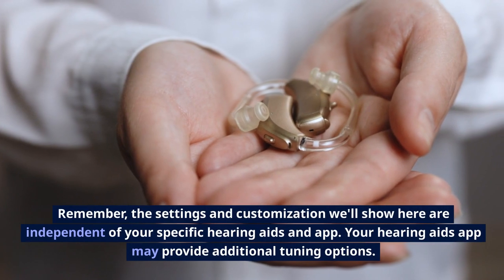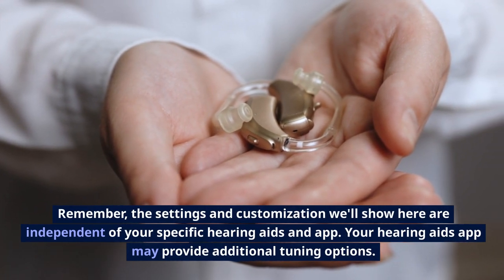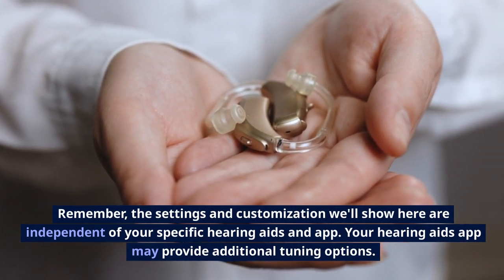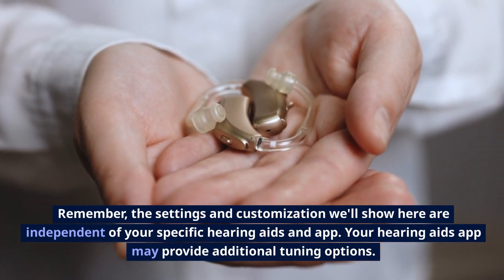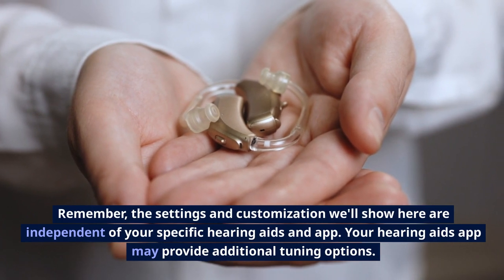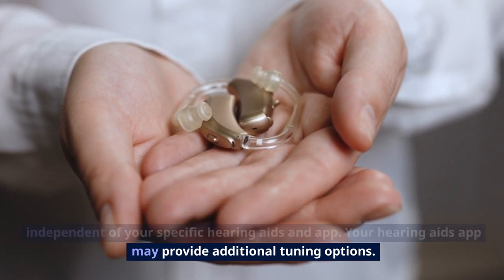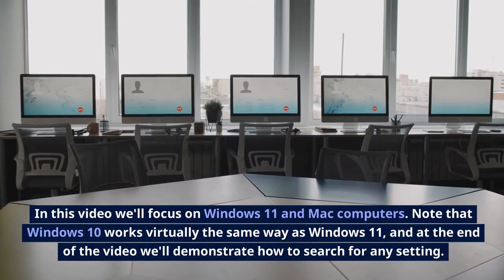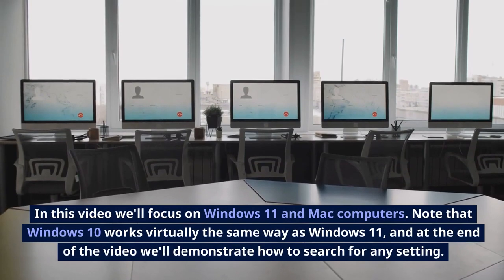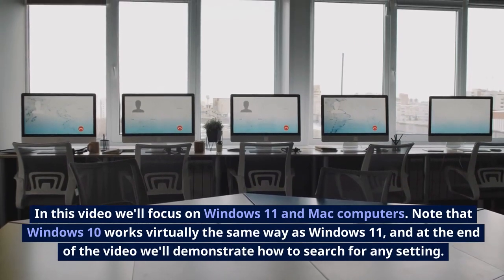Remember, the settings and customization we'll show here are independent of your specific hearing aids and app. Your hearing aids app may provide additional tuning options. In this video, we'll focus on Windows 11 and Mac computers.